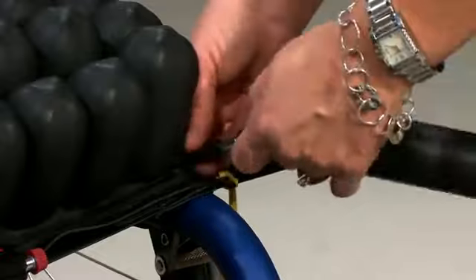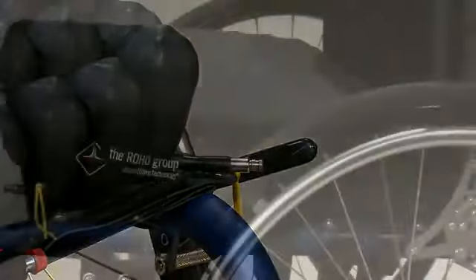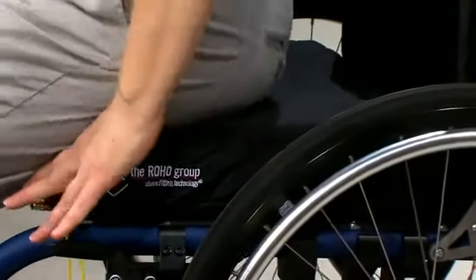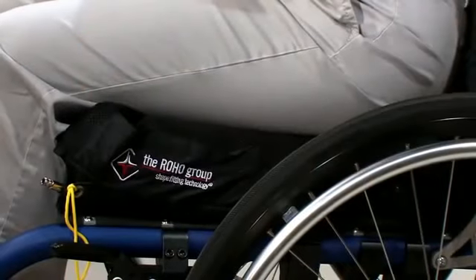Pinch the pump's nozzle and turn the air valve clockwise to close, then you can remove the pump. Have the individual sit in the wheelchair, making sure the cushion is centered underneath. The individual should be seated in their normal sitting position.